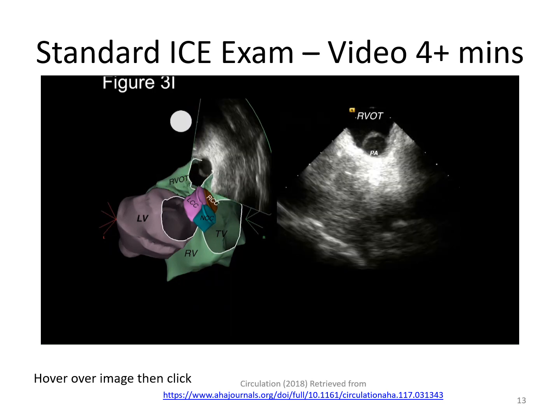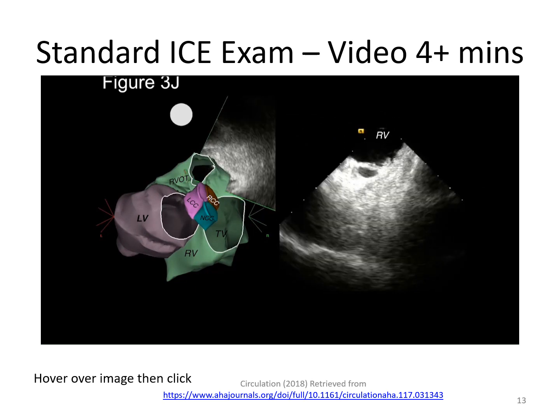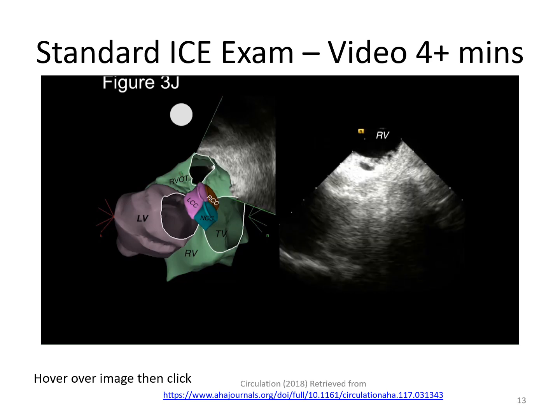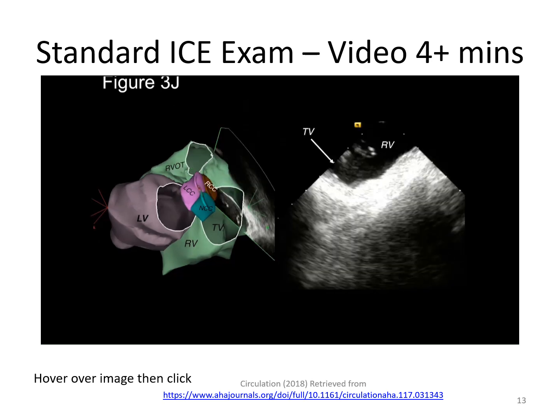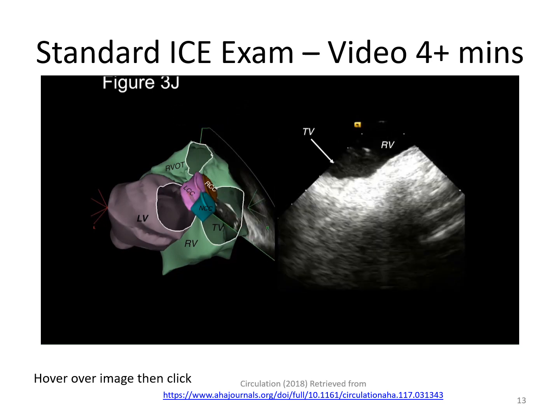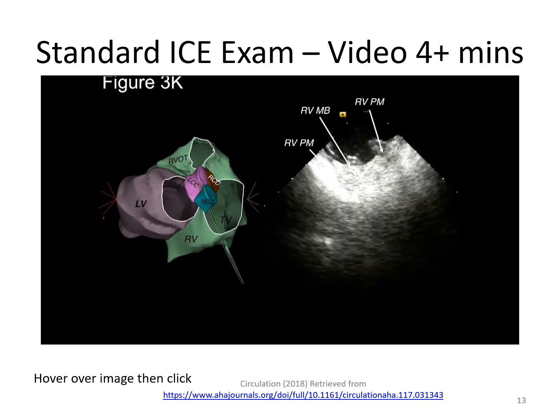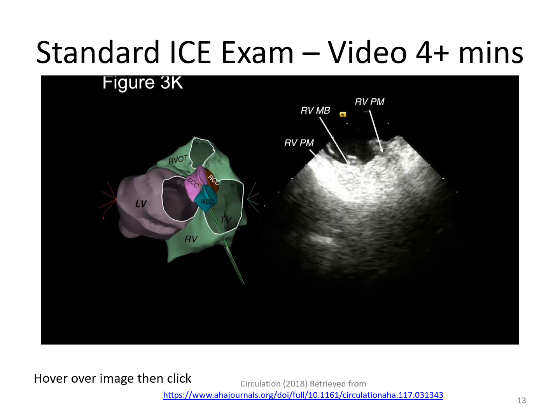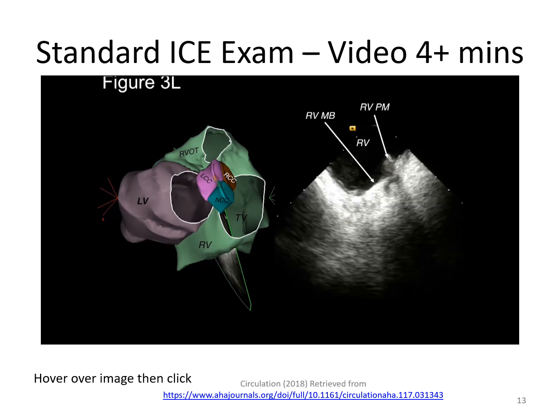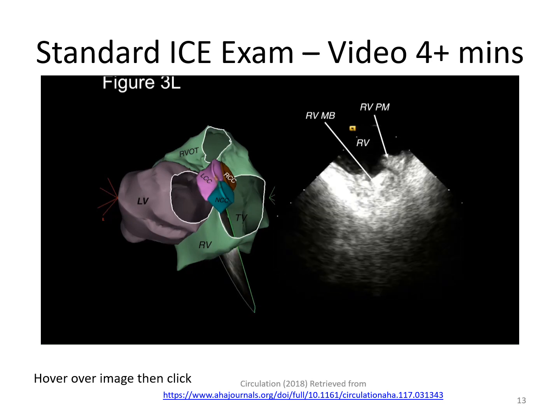separated from the pulmonary artery by the pulmonary valve. Then the lateral and basal right ventricle will come into view. A lower imaging plane, as we rotate the catheter, will show the RV free wall separated by the tricuspid valve from the right atrium. Finally, the moderator band in its lateral insertion and the papillary muscles are seen, and with further rotation, we come back to the initial imaging plane.